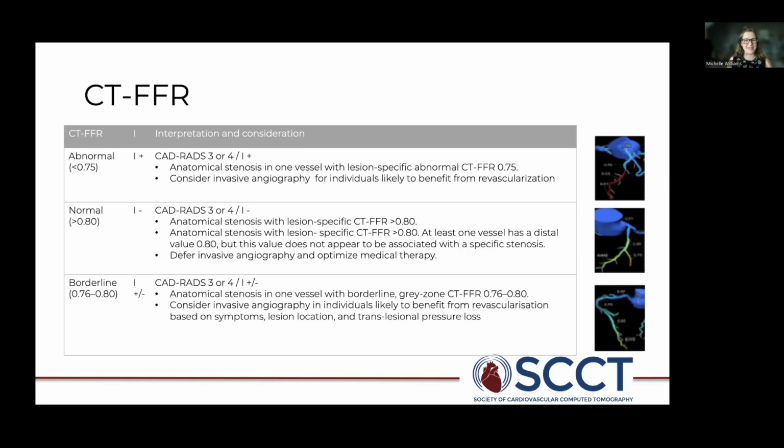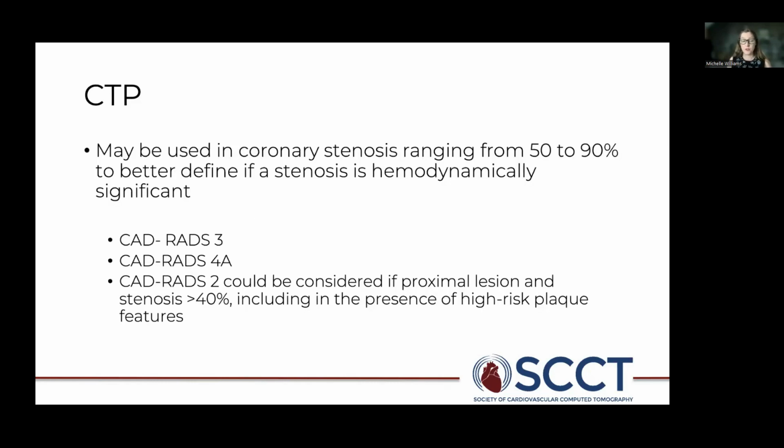Next slide, please. For CT perfusion, it's indicated in a similar range of patients. So the same 50 to 90% stenosis in order to better define their hemodynamic significance. And that's particularly CAD-RADS 3 and 4, but could also be considered in CAD-RADS 2.